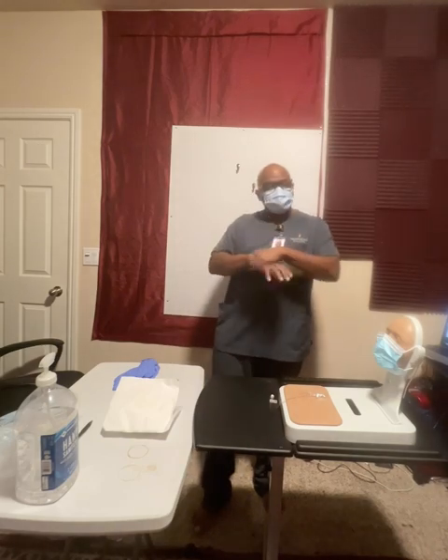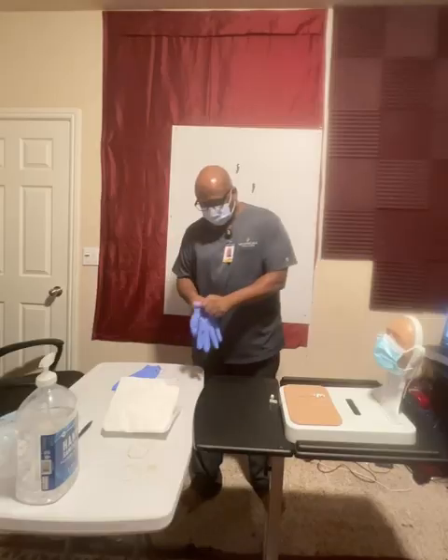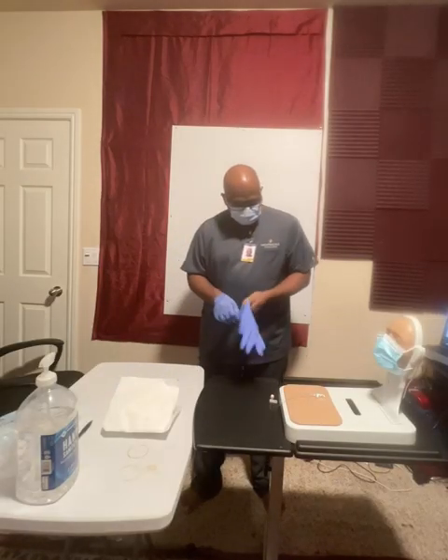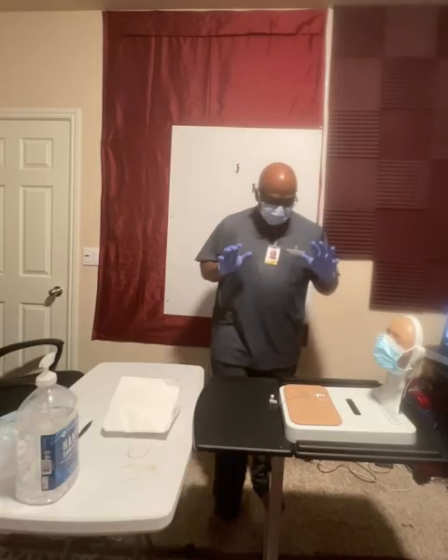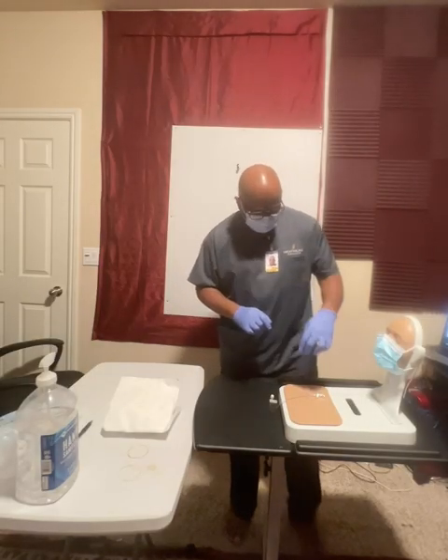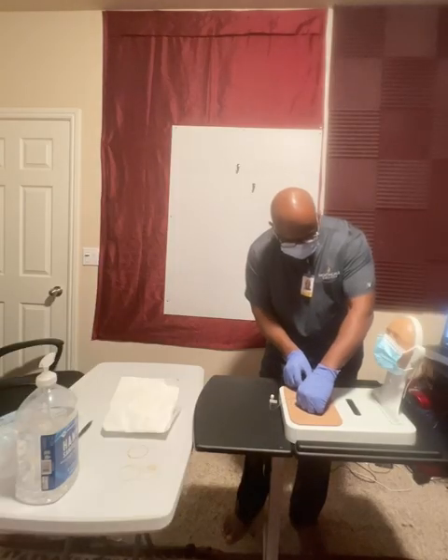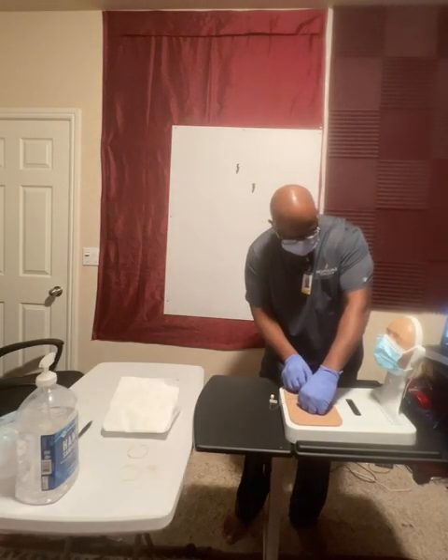Now I can put my gloves on after doing hand hygiene. I'll go ahead and put my gloves on. Okay. Good. Now that my gloves are on, I'm going to stabilize the catheter tubing with my non-dominant hand, and then I'm going to work on pulling up the dressing, the old transparent dressing, by stabilizing the tubing.